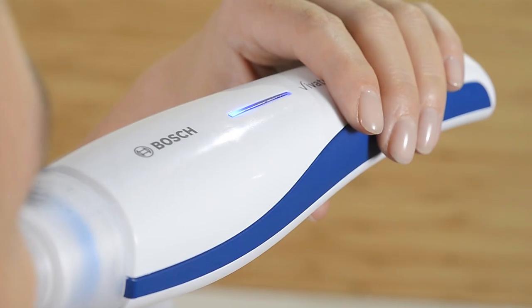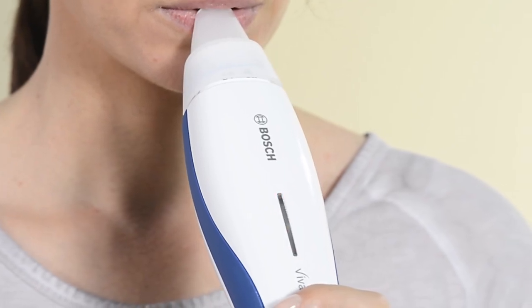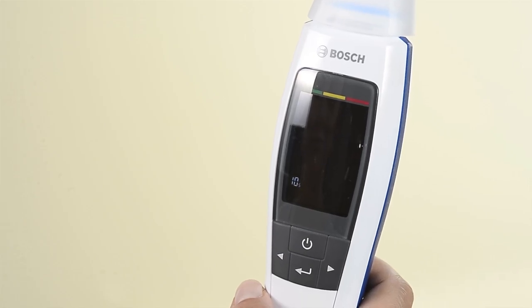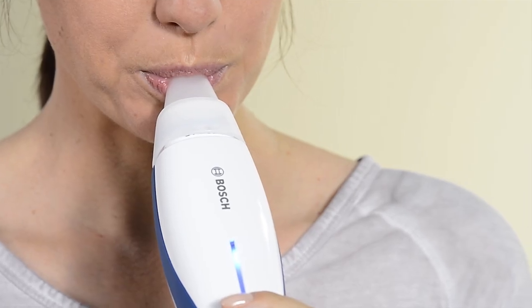You will very quickly get the hang of how hard to blow. If the measurement was not successful, the LED flashes red at the end of the measuring time, and you must repeat the measurement. You can make another four attempts with the same mouthpiece within the next 15 minutes.